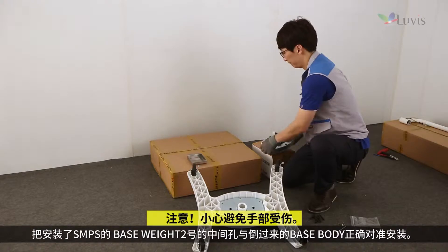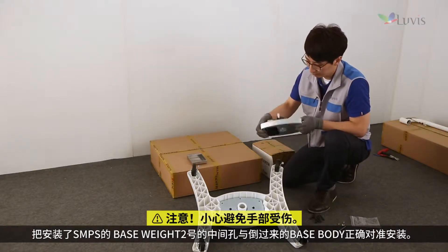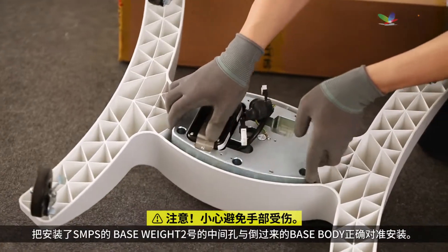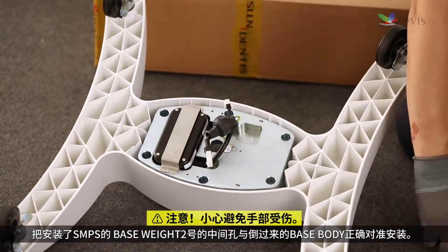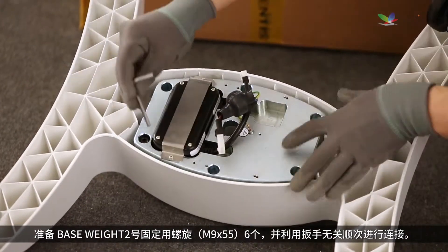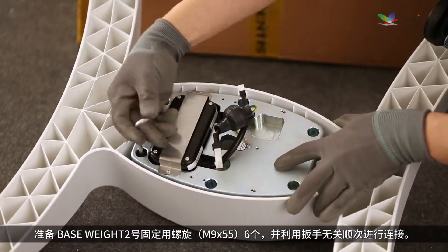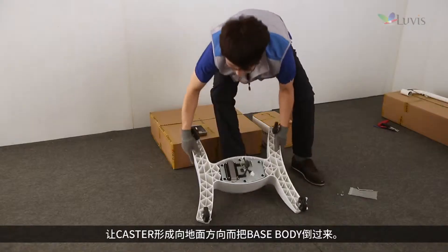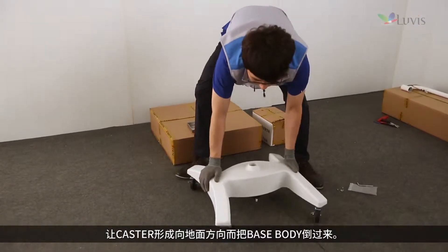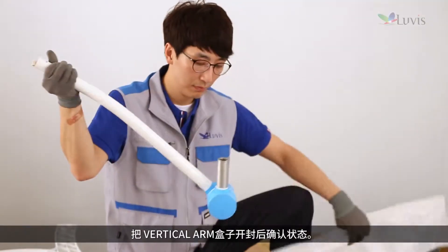Adjust the middle groove of base weight number two, where the SMPS is attached, to the turned-over base body to mount it. Prepare six screws to fix base weight number two and tighten them using a wrench, regardless of sequence. Then turn over the base body so the casters face the floor.